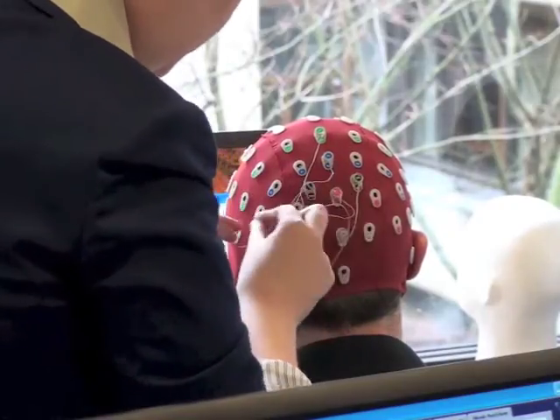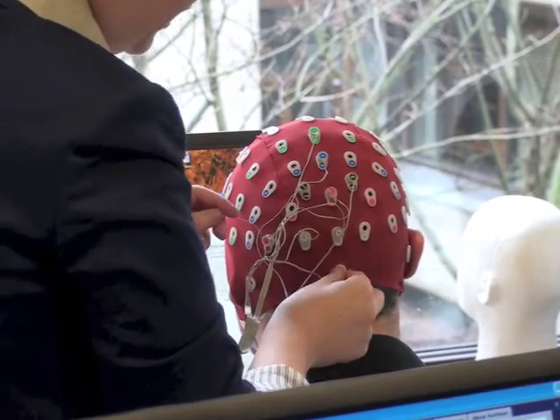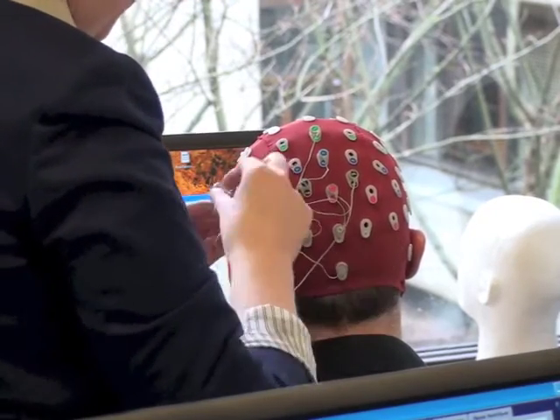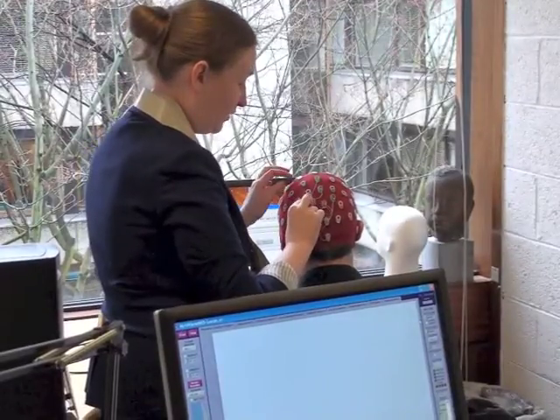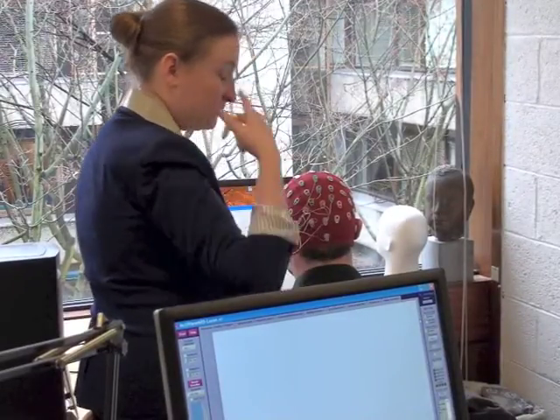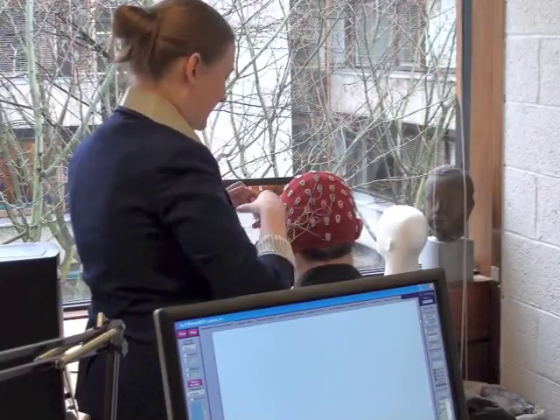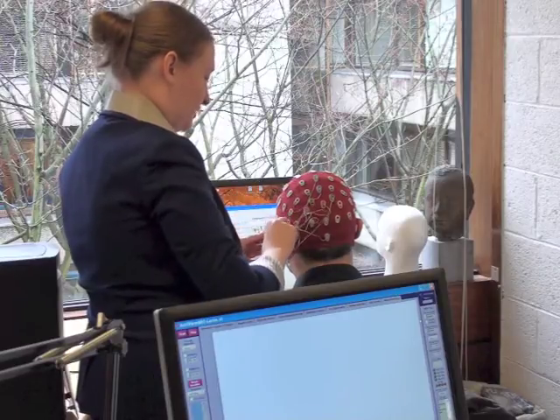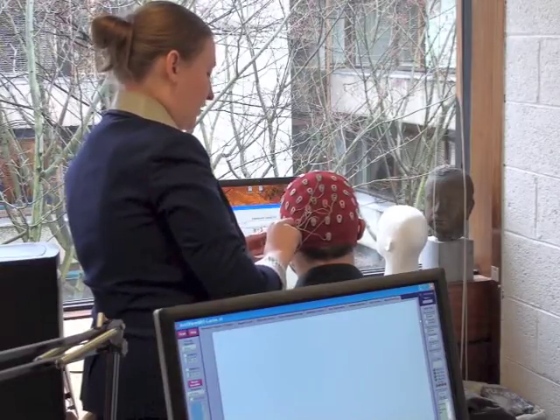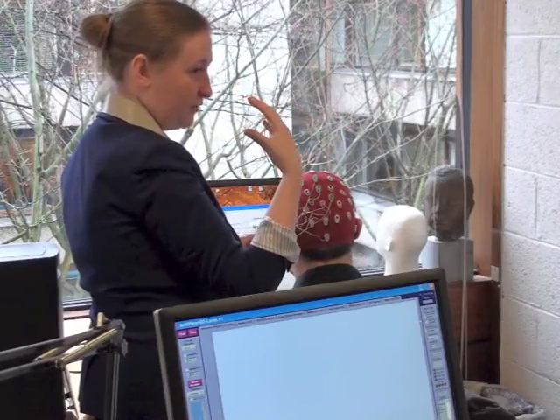But yeah, people generally do leave not upset but incredibly tired and in a bad mood. Because apart from anything else, after all this, they're sitting quite uncomfortable, especially when I stick things on his face in a few minutes. Sorry, Brendan's face. You become uncomfortable, but also you're looking at a bright screen. And remember I said the blinds are closed and the lights are off. The screen seems a lot brighter then.